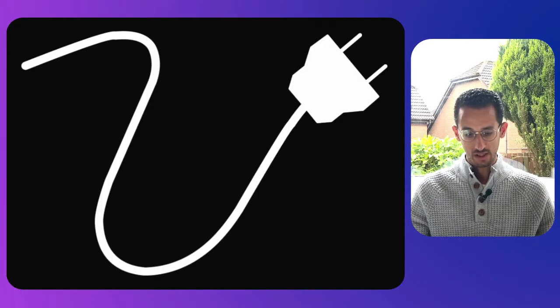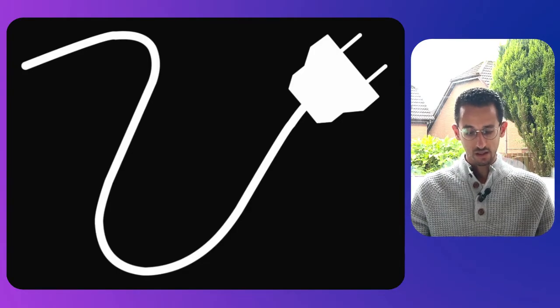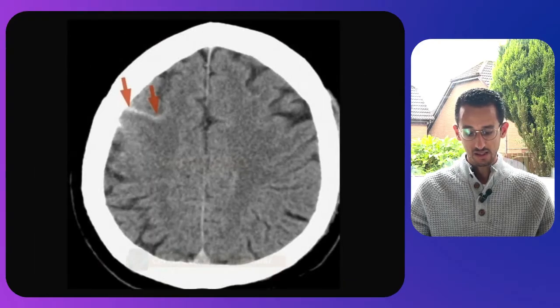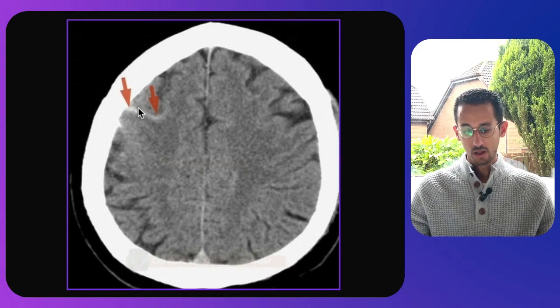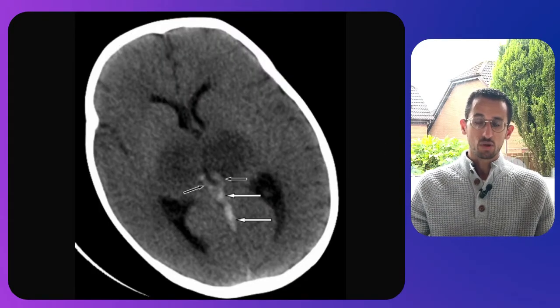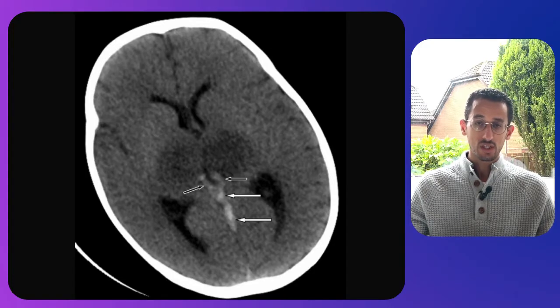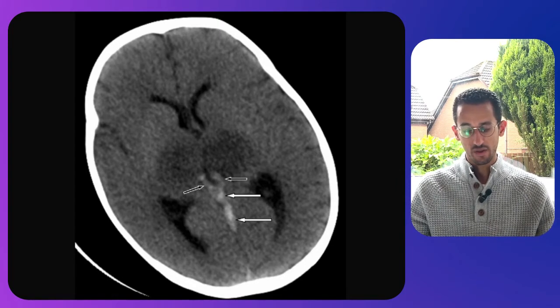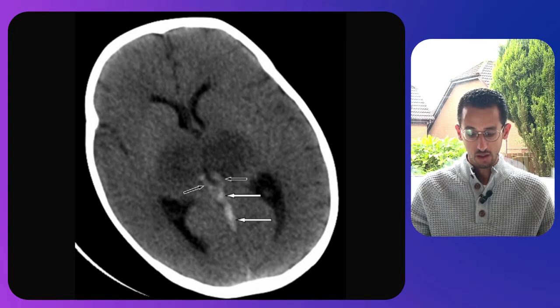Moving to the next one — this resembles a cord sign. The cord sign can be seen in brain imaging in the form of thrombosed cortical veins. On this CT scan you can see something that looks like a cord at the top, which is basically a thrombosed cortical vein. This can also happen in deeper venous structures, as you can see in this CT scan showing thrombosis and opacification within the deep venous sinuses of the brain.